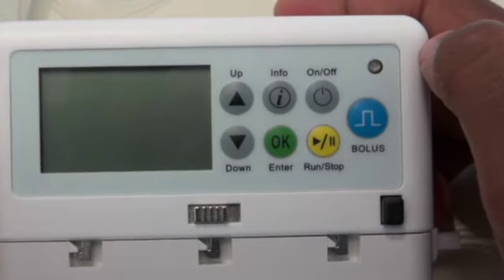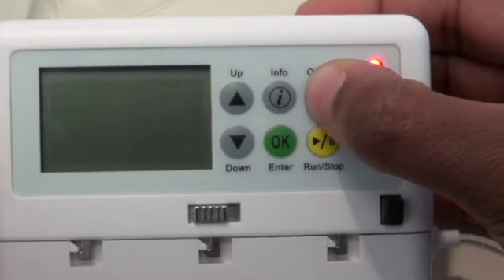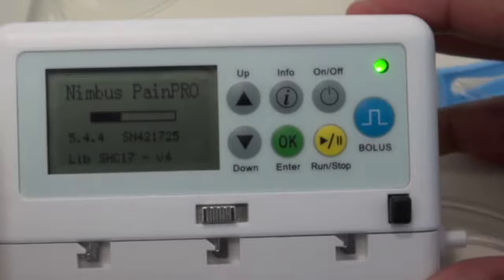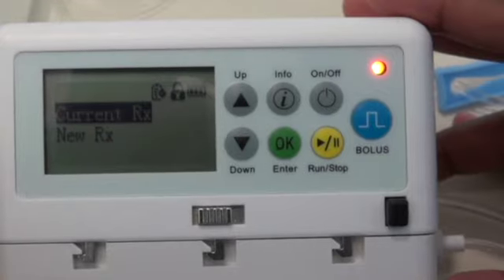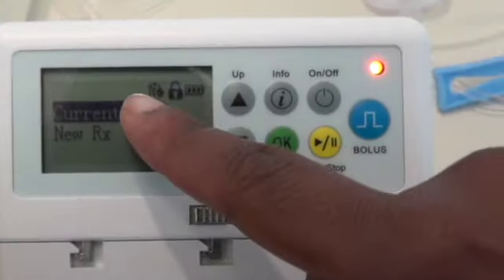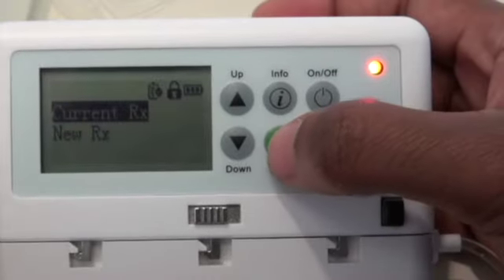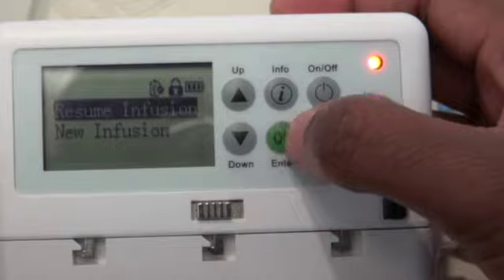We're going to turn the pump on now using the on/off button. You can see there are two menu options: current therapy and new therapy. We're going to choose current therapy, press OK to select, and then go to resume infusion.